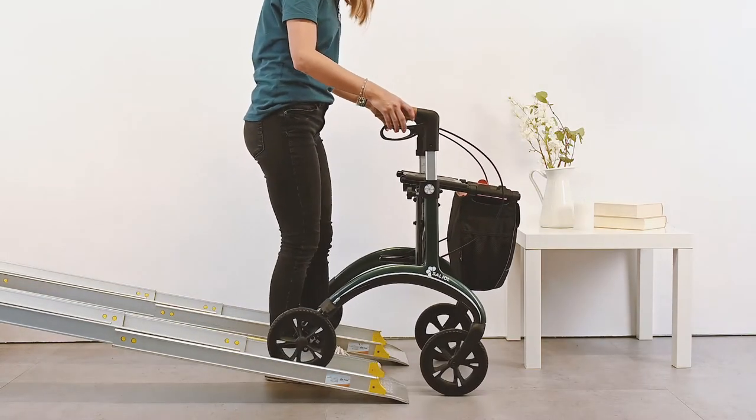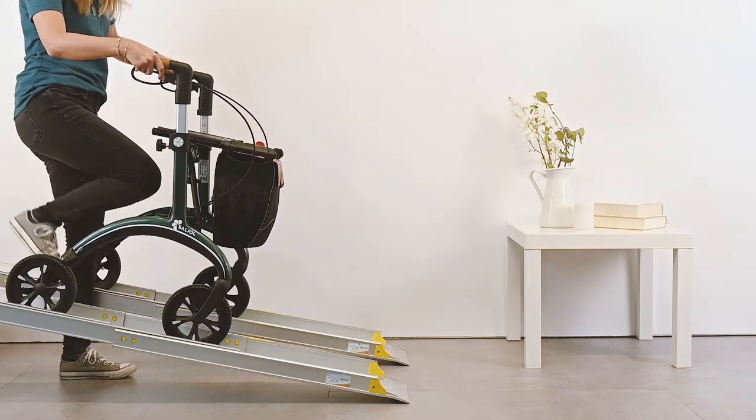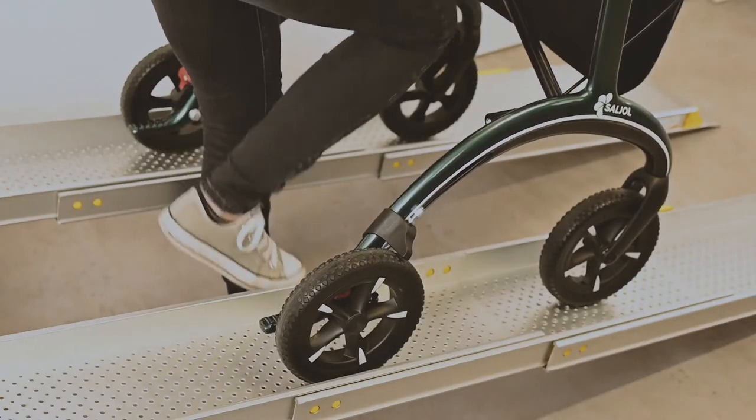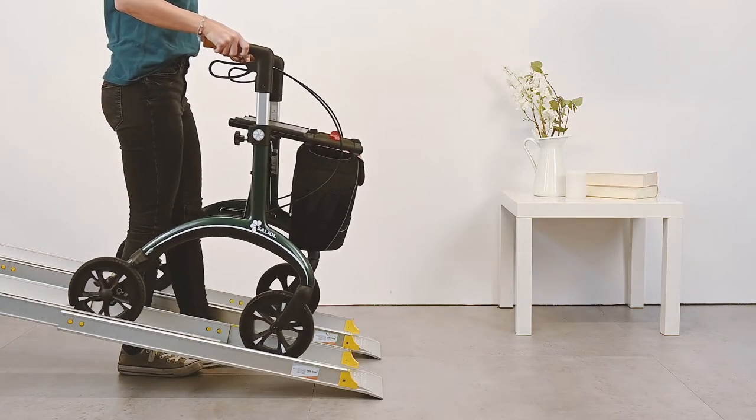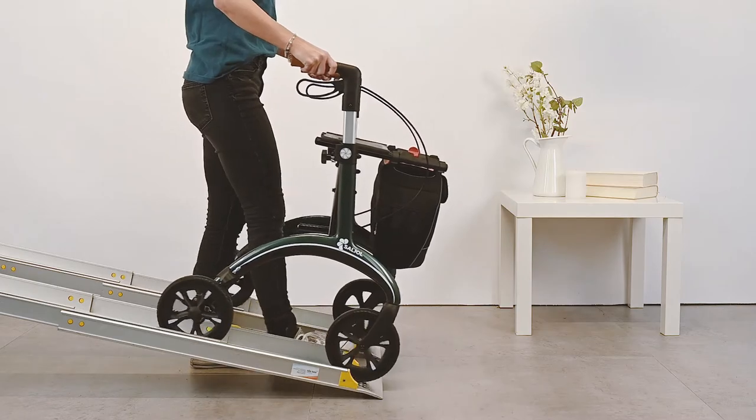The soft rubber tires absorb bumps so that you can easily drive over cobblestones and gravel. When driving downhill the rolling speed increases, but the grinding brake allows you to determine the rolling resistance yourself, so you can safely drive down any slope.